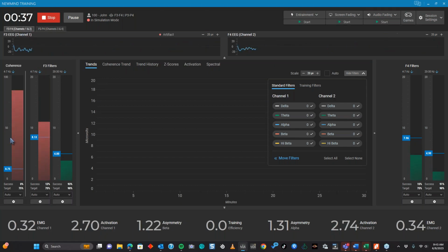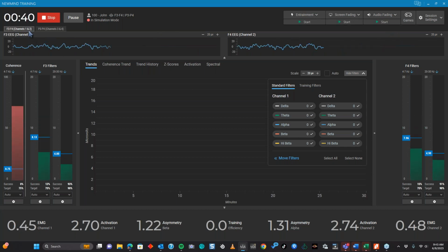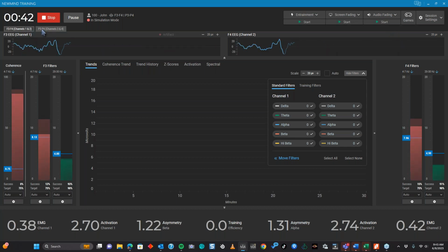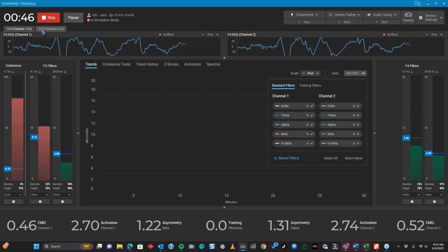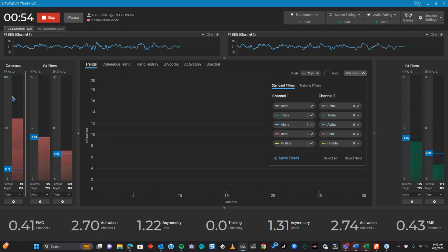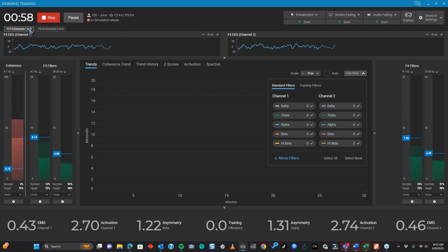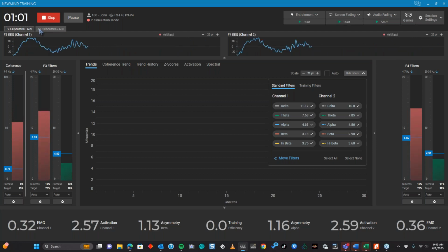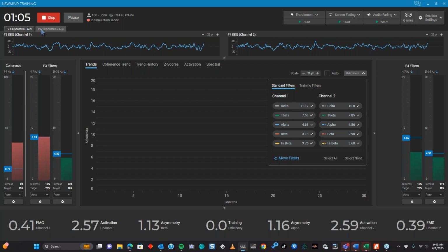Now, to know which site it is, maybe if your coherence is elevated, running in the 60s, 70s, there's a way of actually looking at the coherence of these two sites independently of one another instead of just seeing it all mashed together on one threshold. Okay? And that's going to be in the z-score screens.